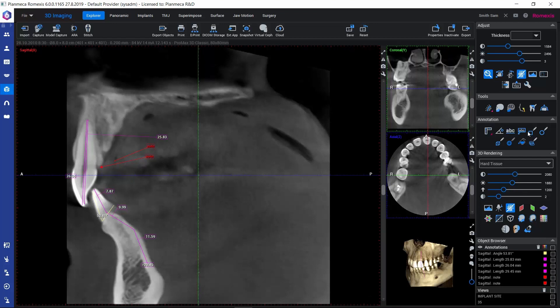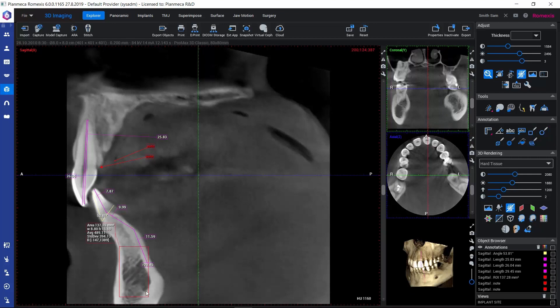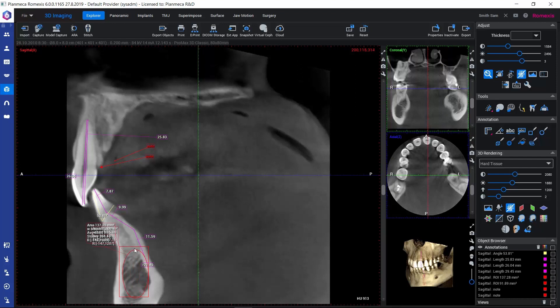We can also draw rectangles and ellipses. With these tools, besides seeing the measures of these shapes, we can also see the average Hounsfield unit value inside the annotation, giving us a rough estimate of the bone quality in that area.